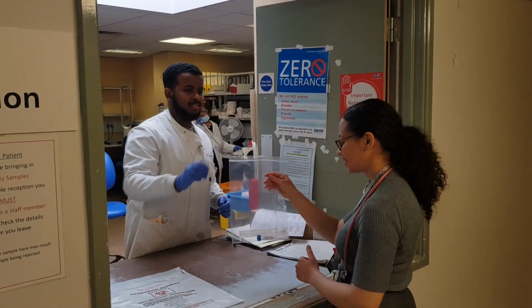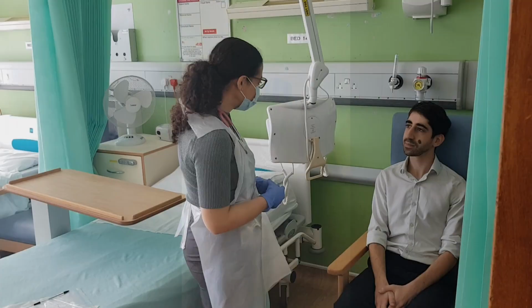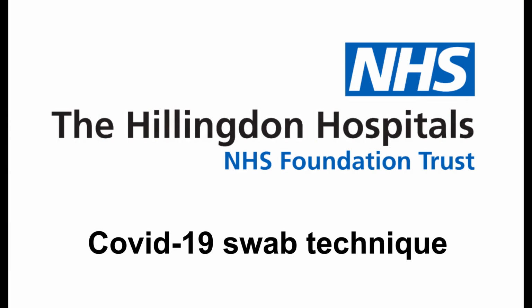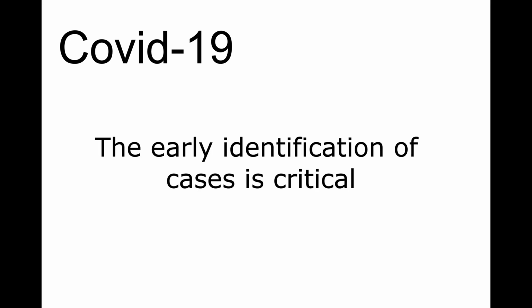Today we will guide you through the swabbing technique to obtain COVID samples for analysis. COVID-19 is an infectious disease caused by a virus of the coronavirus family. The early identification and isolation of patients with the disease and the distancing of those that are healthy but at risk is a critical element in the containment of the disease.